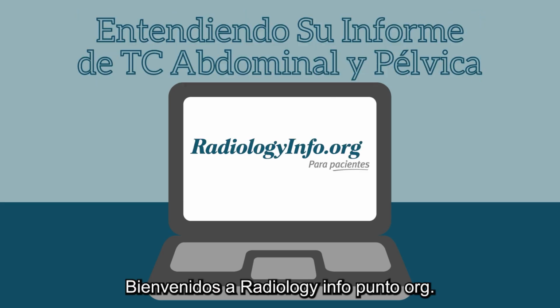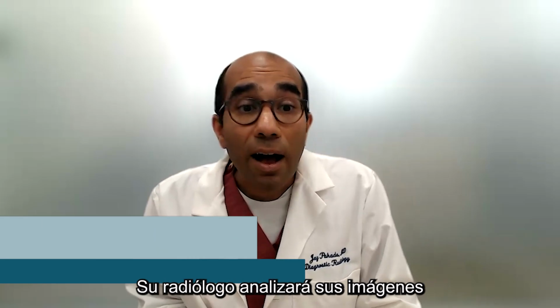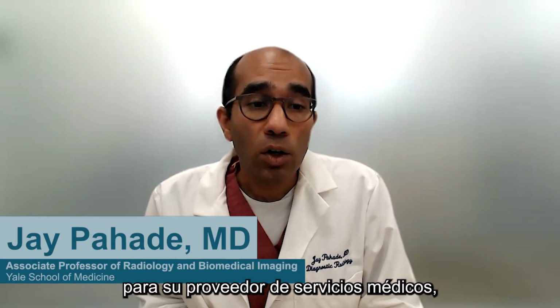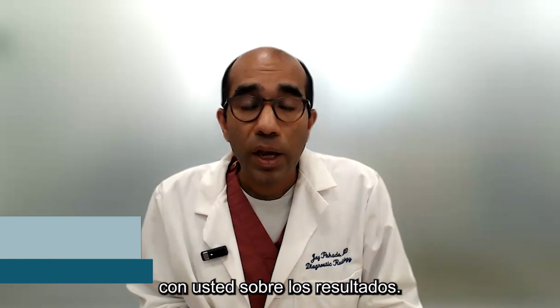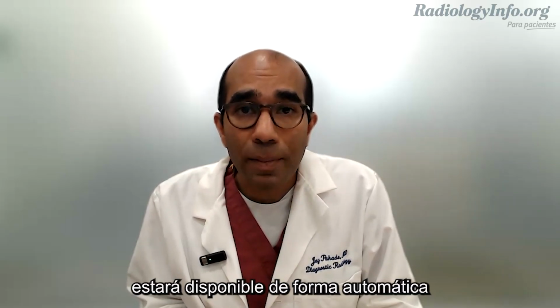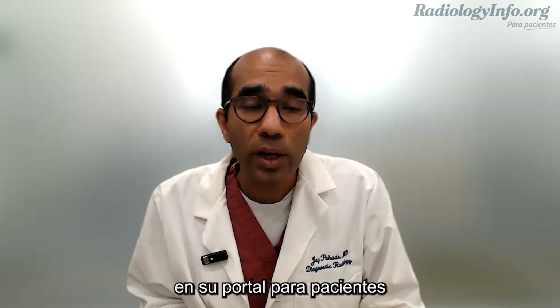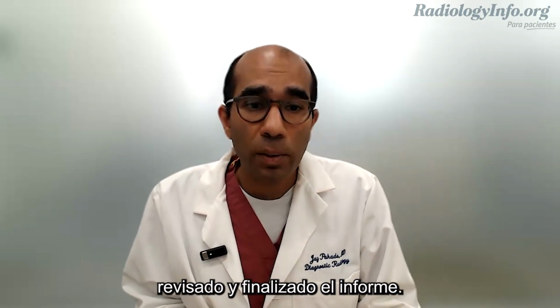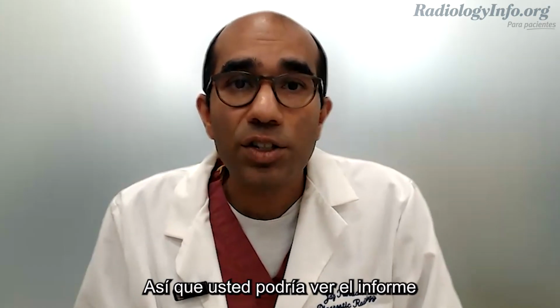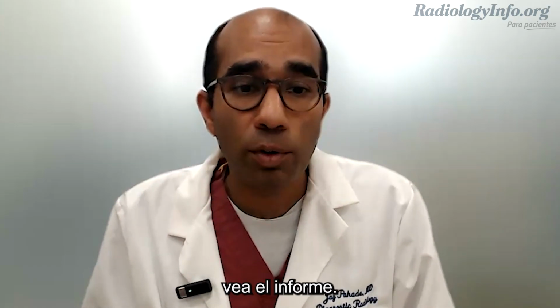Welcome to radiologyinfo.org. Your radiologist will analyze your images and write a report for your healthcare provider, who will then discuss the results with you. At most healthcare facilities in the United States, your radiology report will be automatically available in your patient portal after the radiologist reviews your images and completes their report. So you may actually be seeing the report before your healthcare provider.